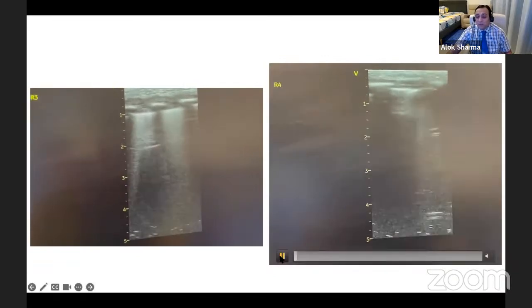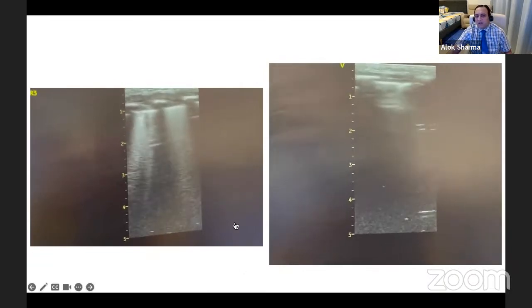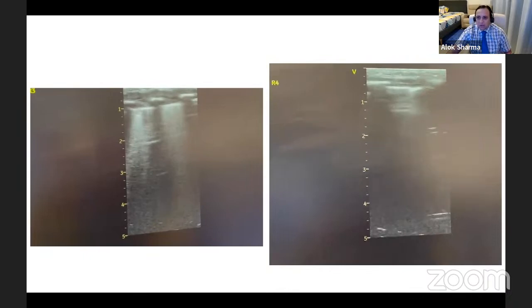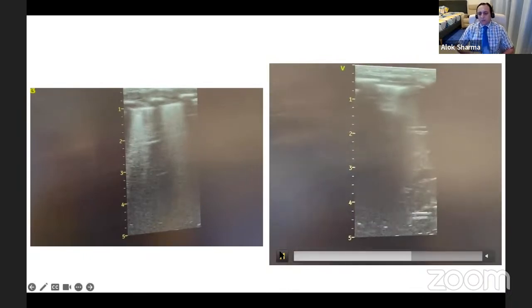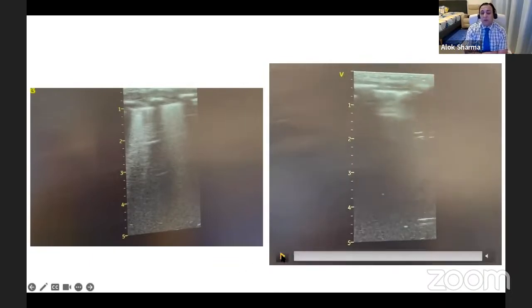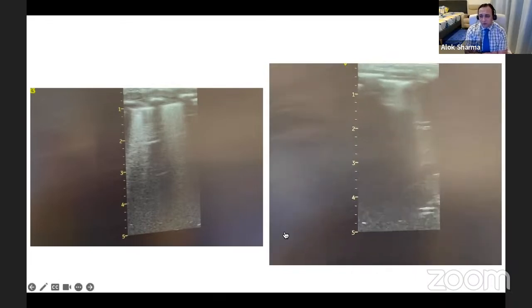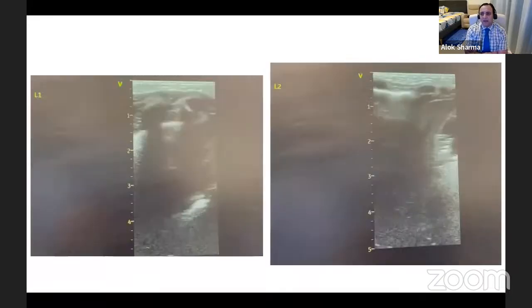That, I would say, is how you make the diagnosis of meconium aspiration syndrome, and there is a classical mix of A, B, C profiles, which I'll talk about today. Clearly this mix changes with time. If you did serial ultrasounds, on day one you might find more of a B and C profile with a lot of consolidation, a lot of B profile, and a lack of A lines because you have a lack of aeration.